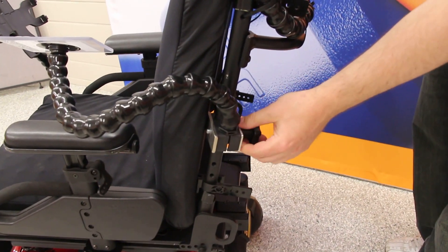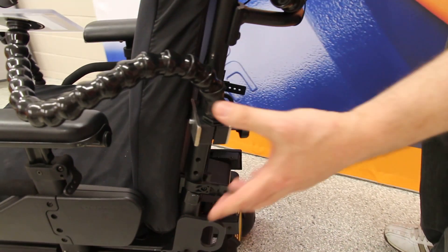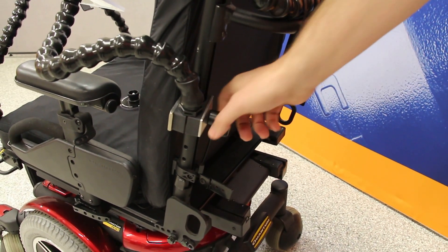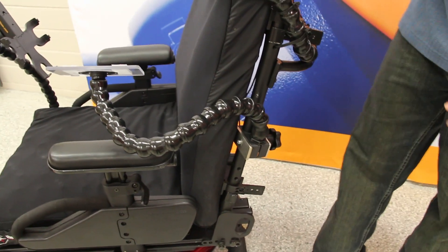This tube clamp attaches onto the wheelchair tubing. Most wheelchairs will have either 1-inch or 7/8-inch tubing somewhere, either on the back of the chair or down towards the bottom, that you can use for attaching. This just screws on by hand — you don't need any tools. You attach the lockline to it and then you can use it for mounting.